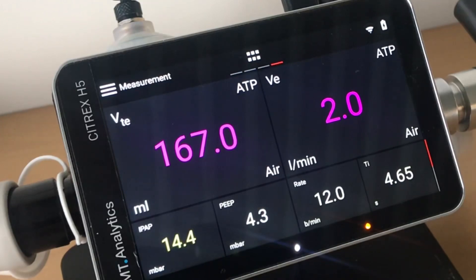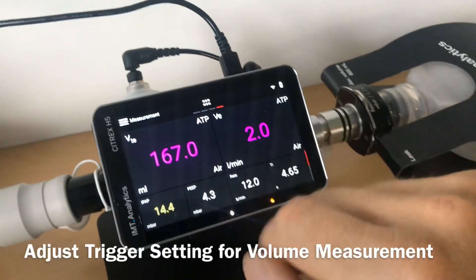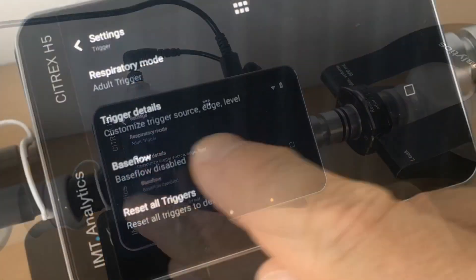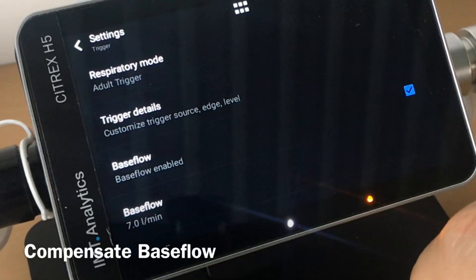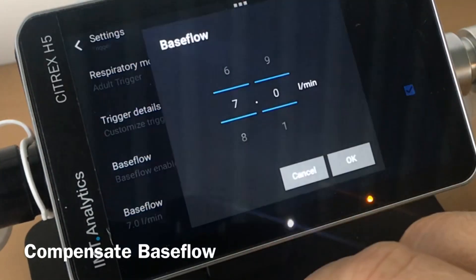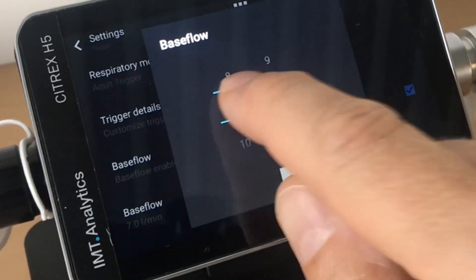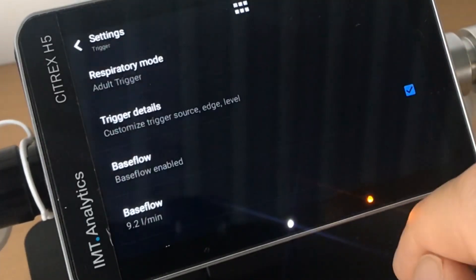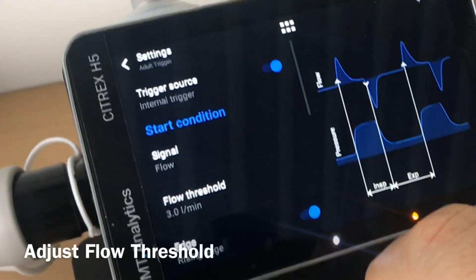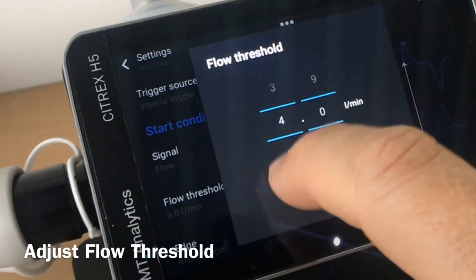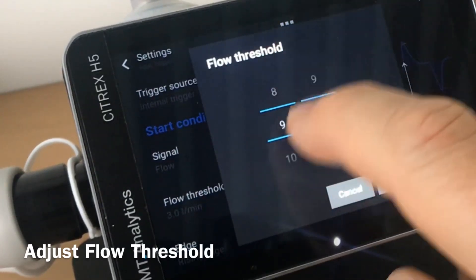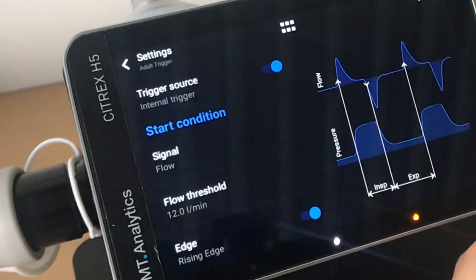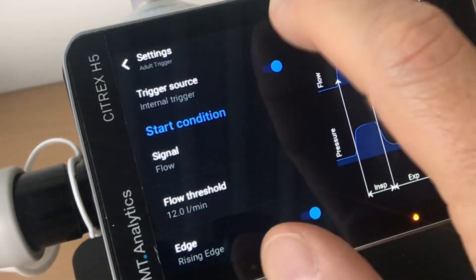So therefore the values shown are wrong. You have to go into the setting screen to the trigger setting, where you can see the base flow. You have to adjust the base flow to the value you measured before, and then adjust the trigger threshold — which is the threshold for when volume measurement actually starts — to about 3 liters above the base flow, in this case 12.